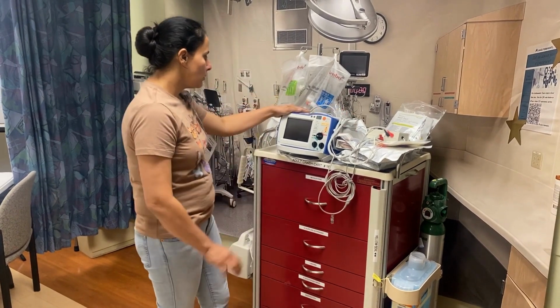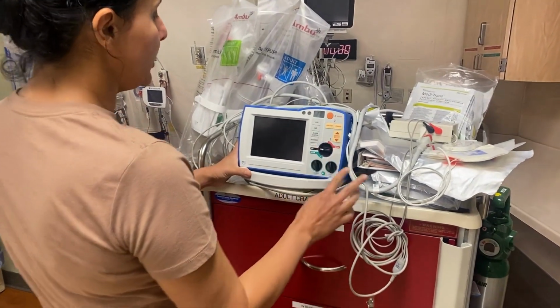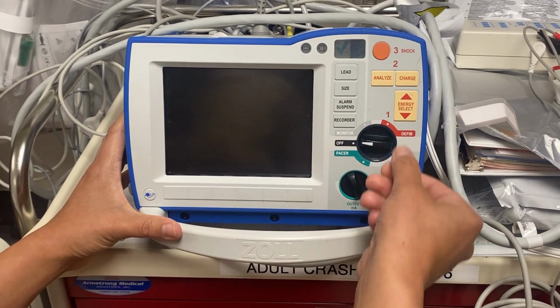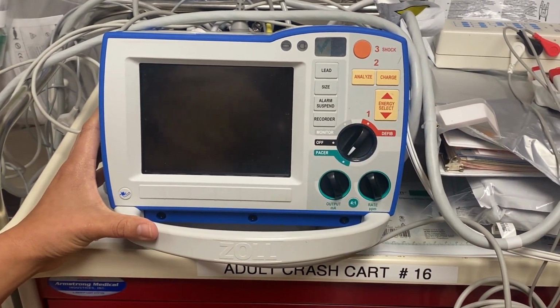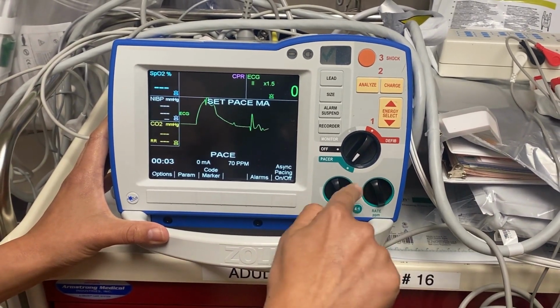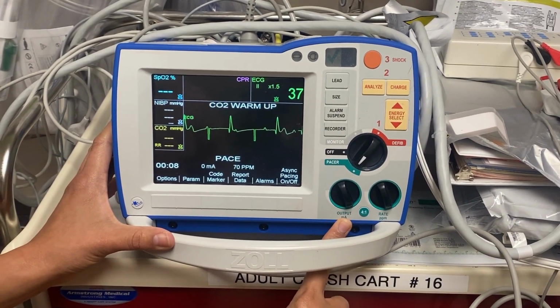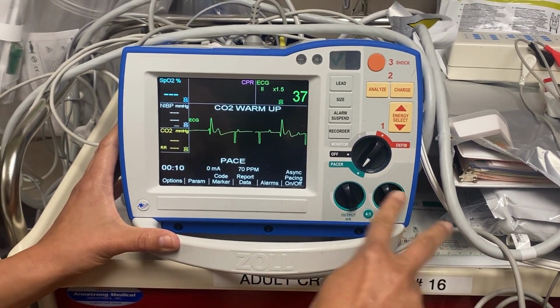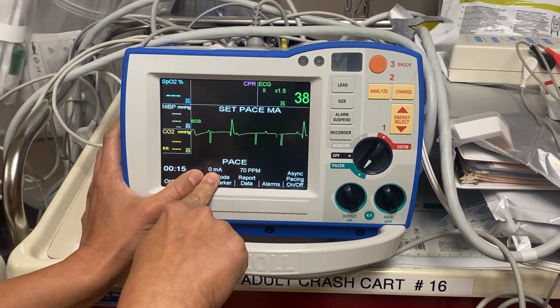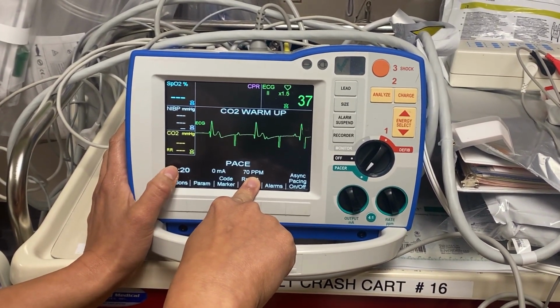I want to show you the Zoll monitor. First, you can see there are 3 sections: monitor, defib, and pacer. As we are going to pace this patient, I'm going to turn on the pacer. Under pacer, it's green in color, and everything in green we're going to use for pacing. There are milliamps output and a rate, and those 2 things we can change. First, it defaults to 0 milliamps, and the rate is usually 70 for better cardiac output on these patients.